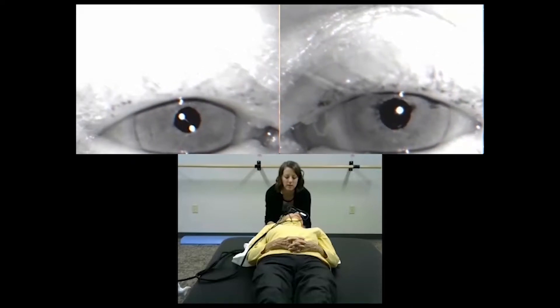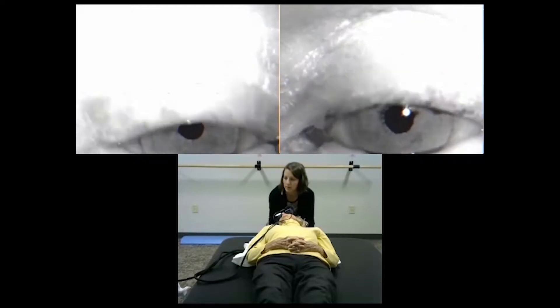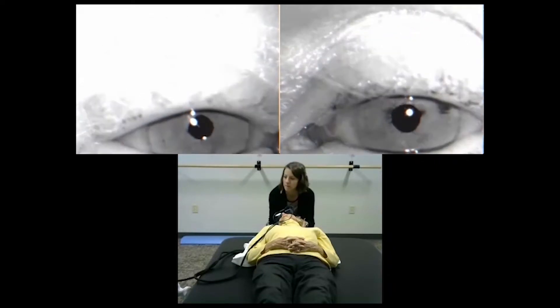Keeping your head back and your chin up, we're going to roll your head to the right side. Don't pick your head up — good. We're going to wait here about 30 seconds. You doing okay? Good.